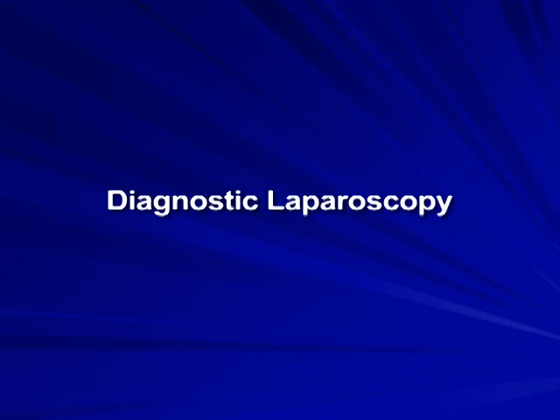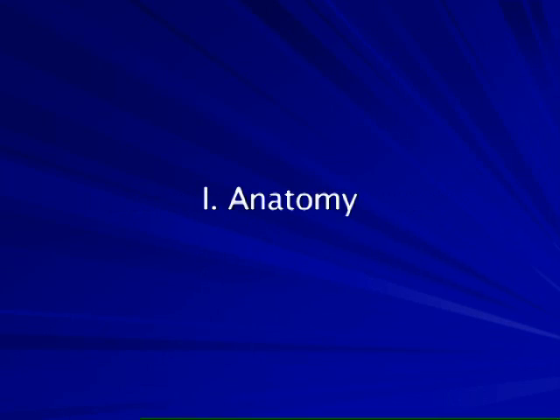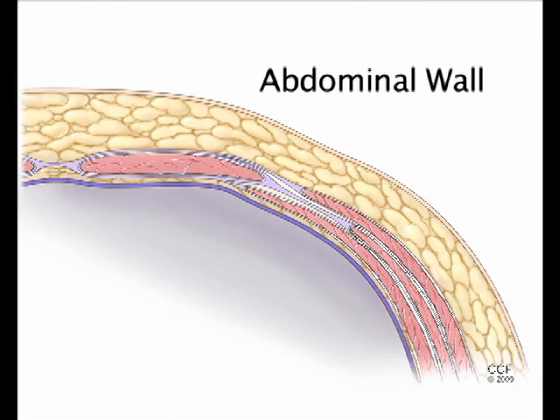Laparoscopic trocar placement. Knowledge of anterior abdominal wall anatomy is critical for successful trocar placement in laparoscopic surgery.